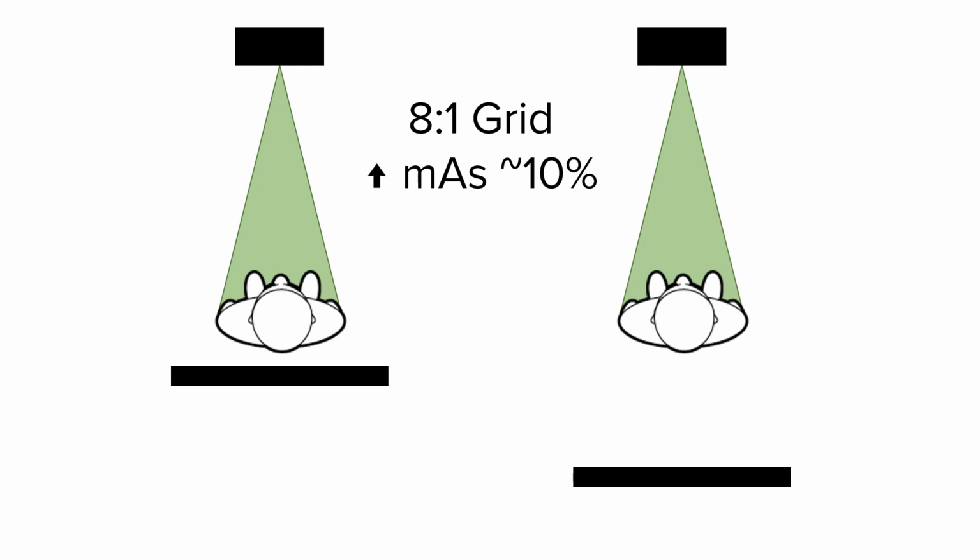A couple disadvantages of using an air gap technique is the increase in technique and the increase in object magnification.